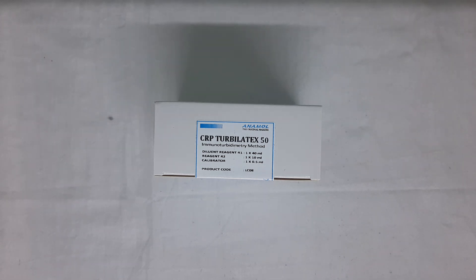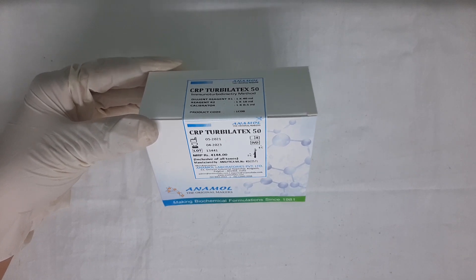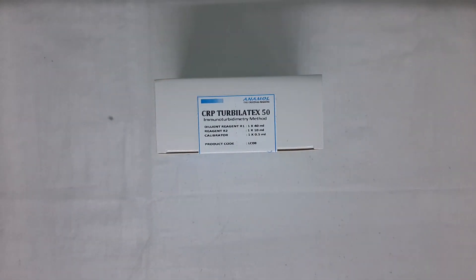Hello everyone. In this video tutorial, we will see the procedure to perform CRP Turbolatex test. In this video, we have used the kit of CRP Turbolatex by Anamol Laboratories Private Limited.